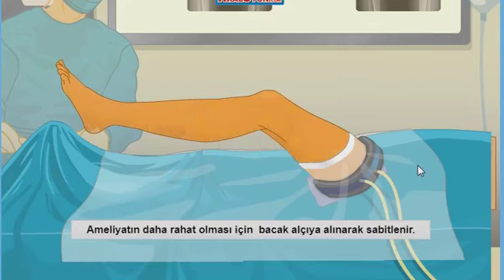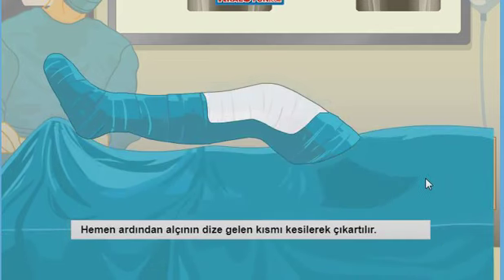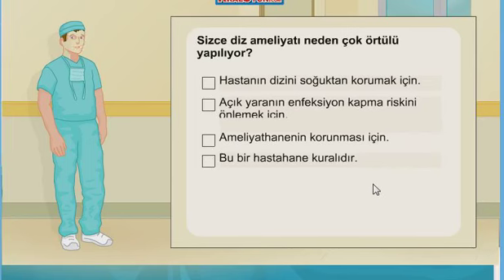The betadine scrub is applied 2 more times, followed by the final arrangement of sterile drapes. Why do you think knee surgery involves so many drapes? Good work.